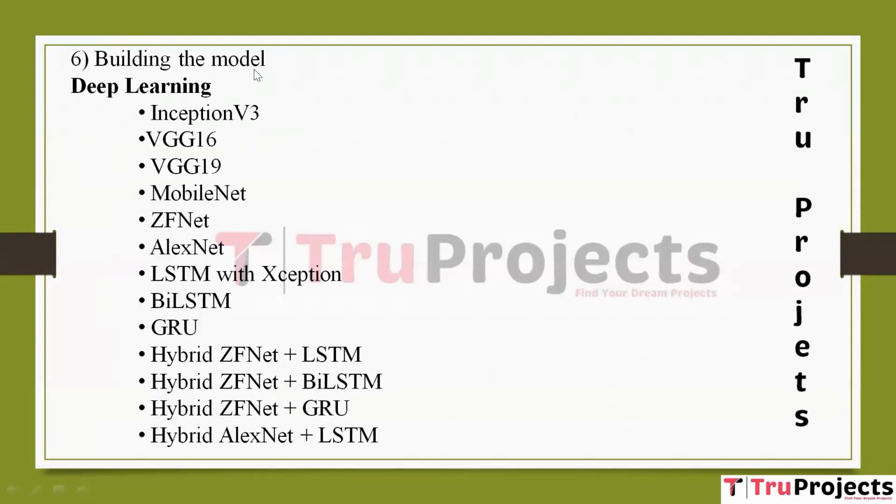Building the model. This is the core of the project, where various machine learning and deep learning algorithms are implemented to detect sleep apnea. The choice of algorithms, hyperparameter tuning, and model architectures, for example neural network layers, are crucial in this phase. The deep learning algorithms include Inception V3. Inception V3 is a deep convolutional neural network (CNN) architecture designed for image classification tasks. It's known for its efficiency in training deep networks while using fewer parameters. In the context of this project, Inception V3 may be applied to analyze ECG images and extract relevant features for sleep apnea detection.